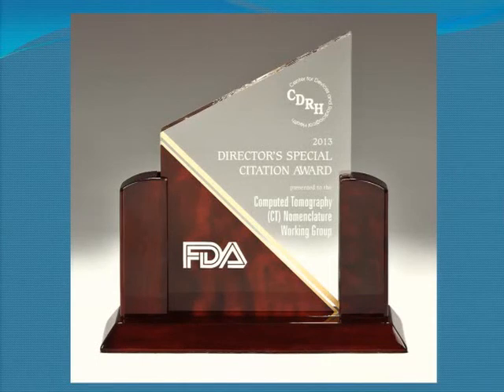It's not great, and I think it's part of why we have some inconsistency in our image quality. Some of the techs will put the patient on the table, look at the localizer, measure him up and say, I think I need something a little bigger for this patient, and push him into the larger size and the larger technique. And others will say, I can scrape off some of this fat and use a tinier display field of view and go to a smaller size than probably is wise for that patient. So it's not great, but that's what we're using.